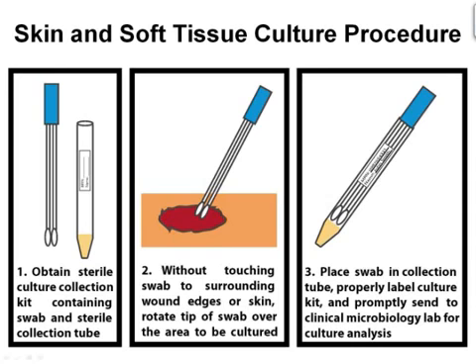Secondly, the swab is rotated over the middle area of the wound carefully so as to avoid contact with the surrounding edges. This will minimize possible contamination caused by normal skin flora. Lastly, the swab is placed in the collection tube, labeled, and promptly sent to the clinical microbiology laboratory where the specimen will be spread over agar and incubated.